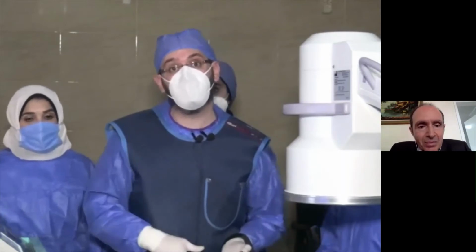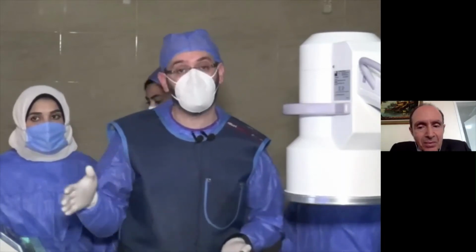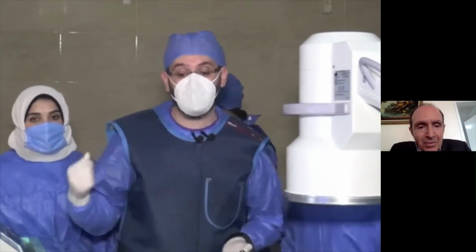I'm here working from Mansoura University. I am assisted with Dr. Asma and our nurses Shaima and Dalia.